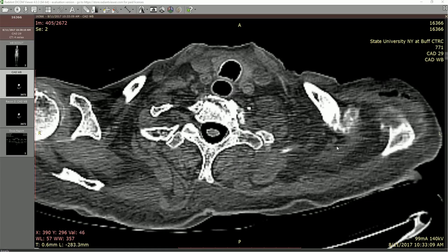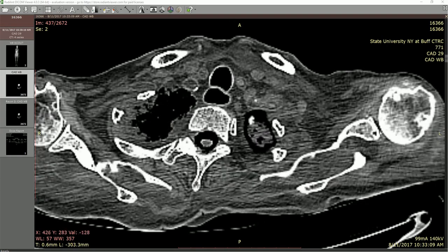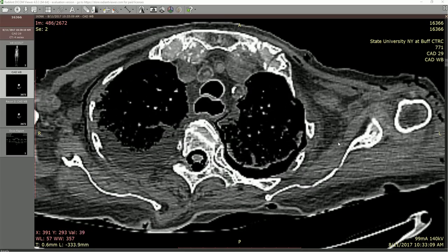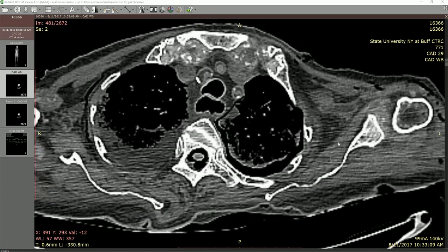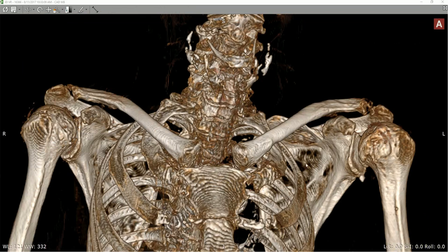One last thing of interest before we move out of this area, getting into some pathology: we have the coracoid process and the glenoid fossa. As we move down into the actual body of the scapula, it's very subtle, but when you look at the body here, you'll notice little gap areas where it almost looks like there's no bone left — and that's because there isn't. This is quite common in an elderly individual where the scapular body will completely deteriorate away. You actually have fusion between subscapularis on the anterior side and infraspinatus on the posterior side.